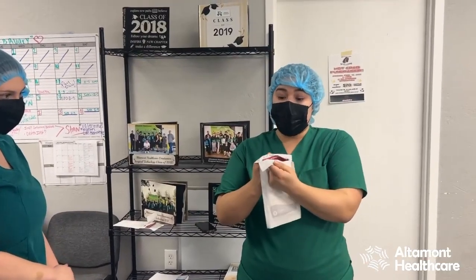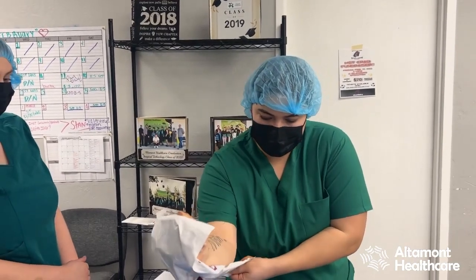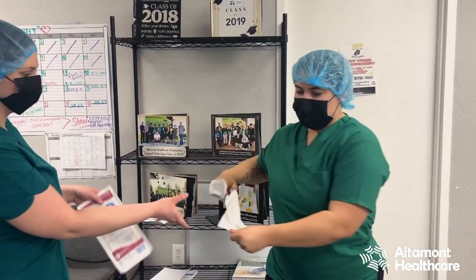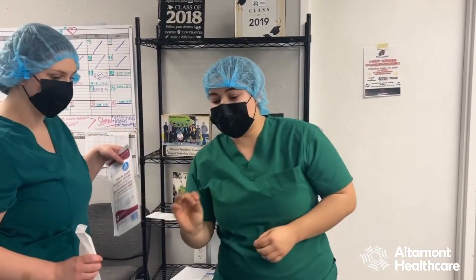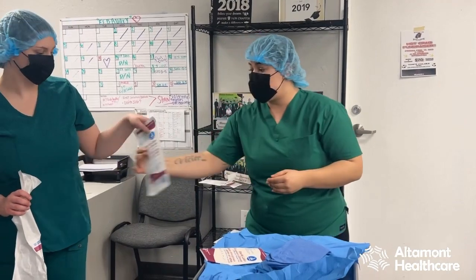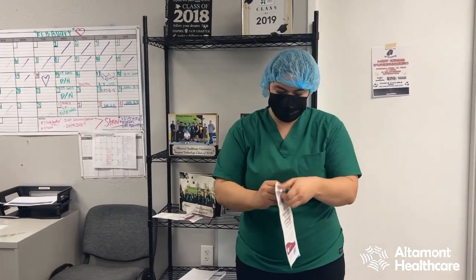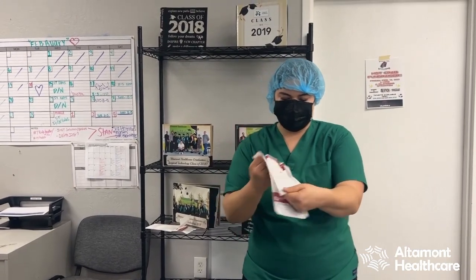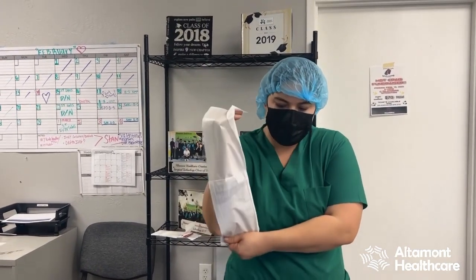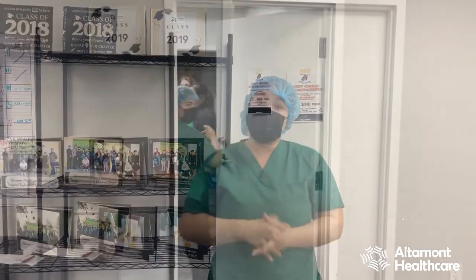Now I will be popping this pair of gloves — barely. You may not see it, but I'm safe because this piece of paper actually saved my gloves from hitting the mayo stand. Throw away your garbage. Once everything is open, now I can go perform my surgical hand scrub.